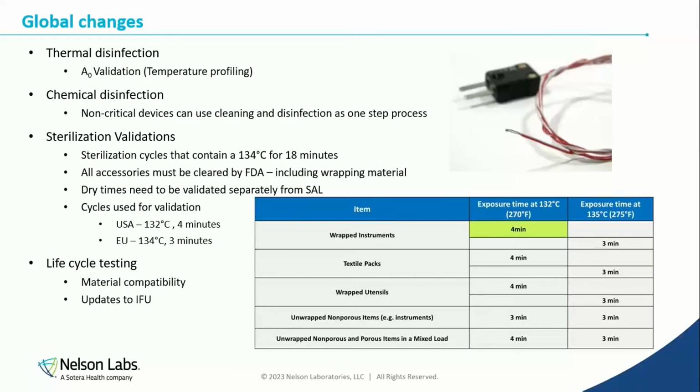And if it's an end process, yes, of course you have to do a validation for it. But this is the intermediate process, between cleaning and sterilization, but it opens on the clean side, so the users are holding these devices and they want to make sure that they're safe for handling. And so we're seeing these as a requirement for any European submissions. So if you haven't yet addressed that, I highly recommend that you look at that and address that.